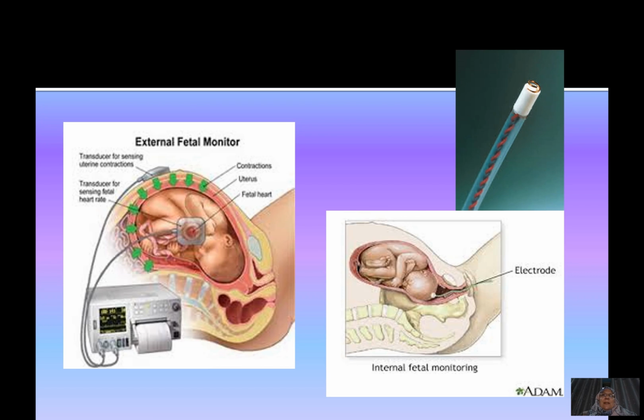As an alternative, there's the fetal scalp electrode that can be used only during labor when the membranes are broken and the cervix already open, and it helps if there's a lot of loss of contact. This probe for fetal monitoring keeps the contact available.